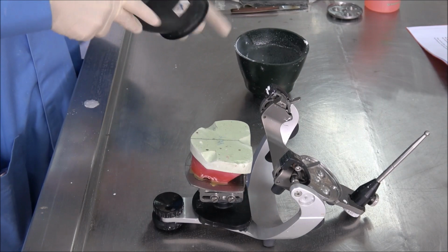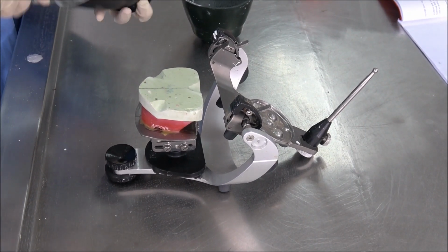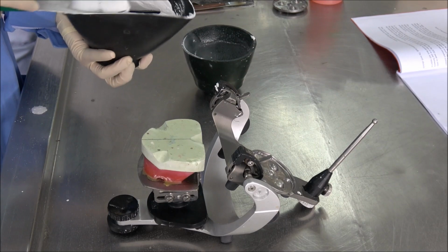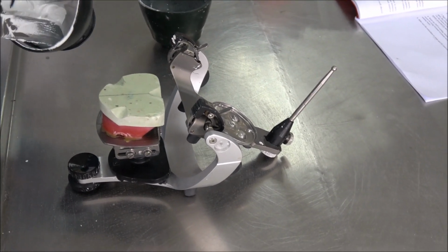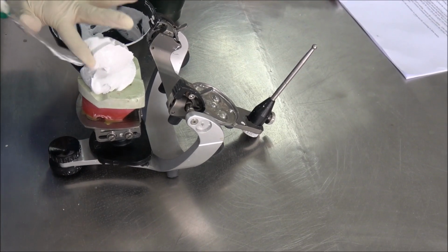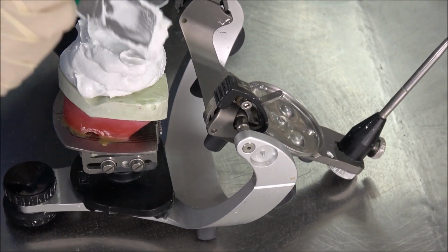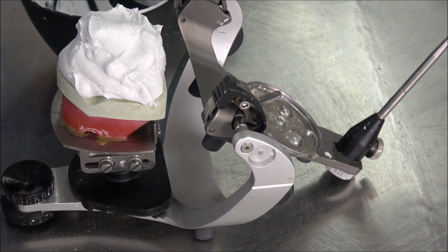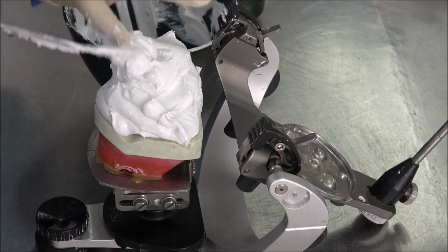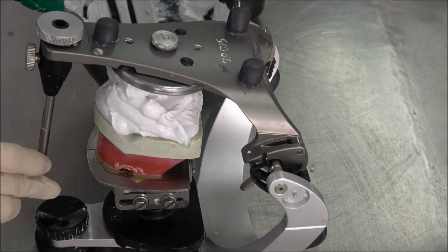Make sure it is mixed properly. Then we're going to put our POP on top. We just put it and then we just close it, to see whether it is enough or not.